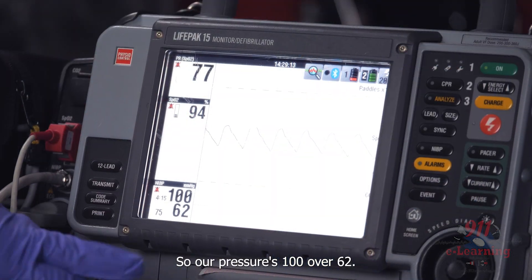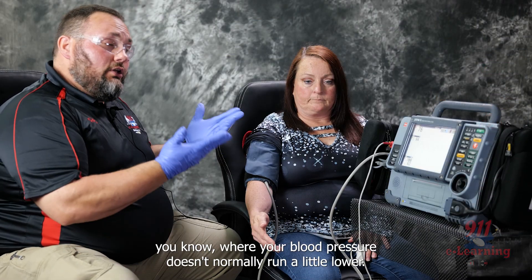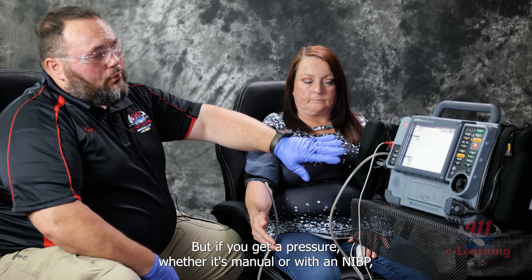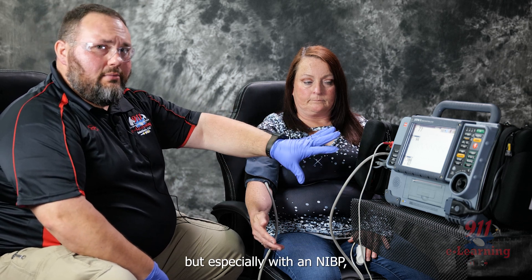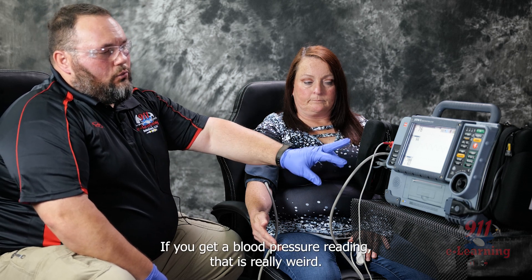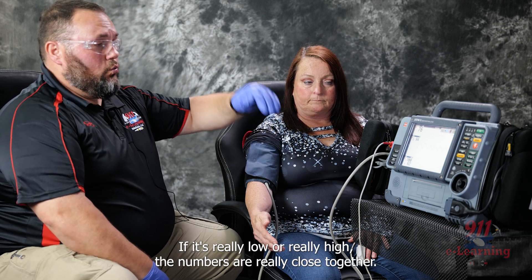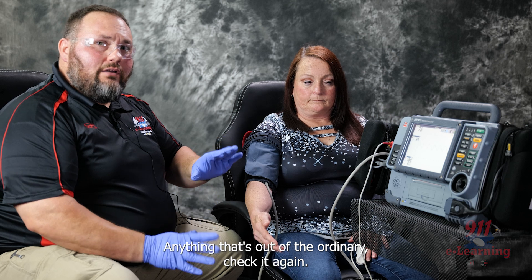Our reading is 100 over 62 — that may be a normal blood pressure for this patient. I'd ask whether their blood pressure normally runs a little low or a little high. But if you get a pressure — whether manual or with an NIBP, especially with an NIBP since it's a machine and machines can make mistakes — and it's really weird, really low or really high, or the numbers are really close together, anything out of the ordinary, that warrants a double-check.